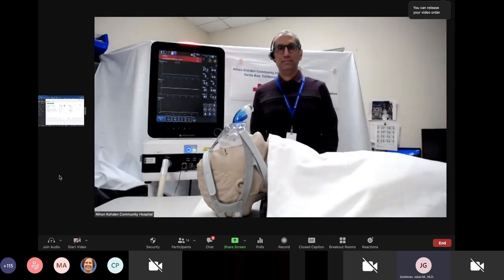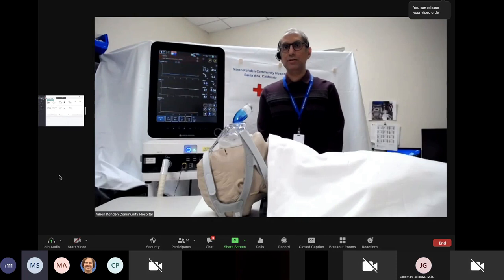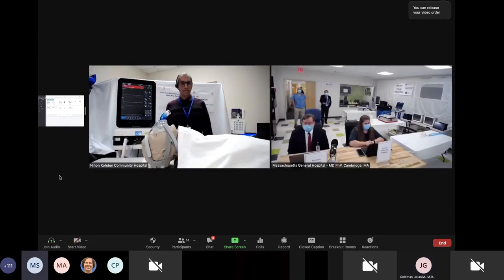Let's start the simulation. Hi, Dr. Goldman. This is Miran from the Nihon Kohden Community Hospital. Hi, Miran. How are you today? What's up? Doing well. We've got a patient here on spontaneous mode who's having trouble breathing on his own, and his O2 saturation levels have gone down. Our respiratory therapist is currently assisting other patients, and I was wondering if you could help us.